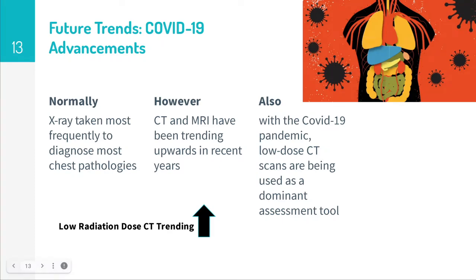Although a swab test is most ideal and accurate in diagnosing a patient with COVID-19, CT and X-ray scans are being completed more regularly because the imaging may help with assessing the seriousness of the disease. With COVID-19 being a very contagious disease, CT scans must be completed at sites where there is less traffic or a mobile CT scanner must be used.